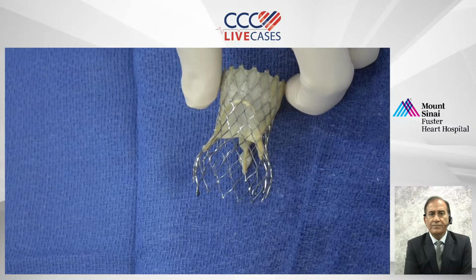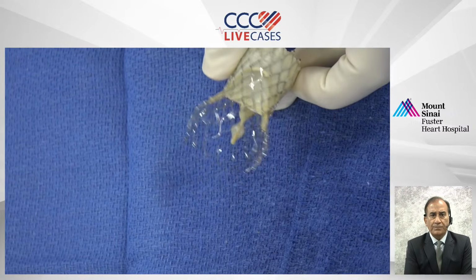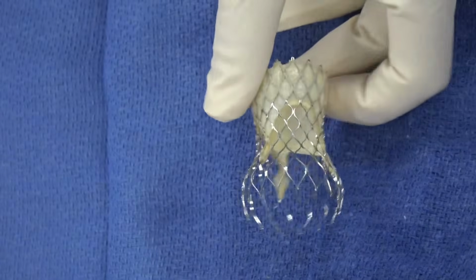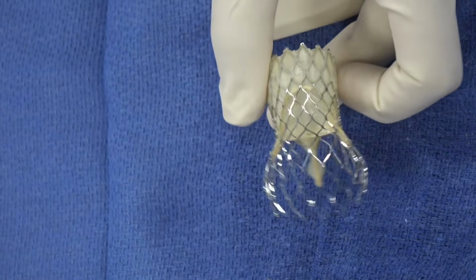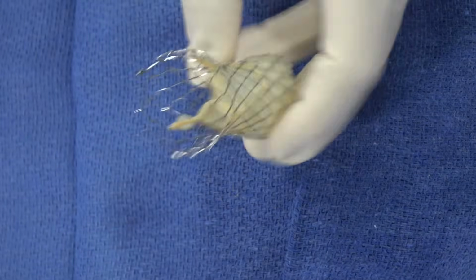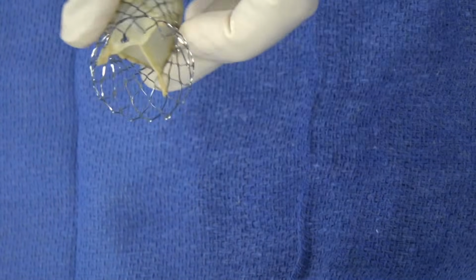Anu, you're showing something? No, there was a question: would the diamonds be distorted, disrupted? I just want to give people an idea what the TAVR valve looks like. First of all, the way we are placing the TAVR valve, we definitely do what's called commissural alignment.